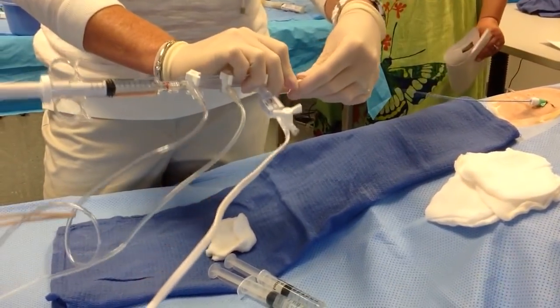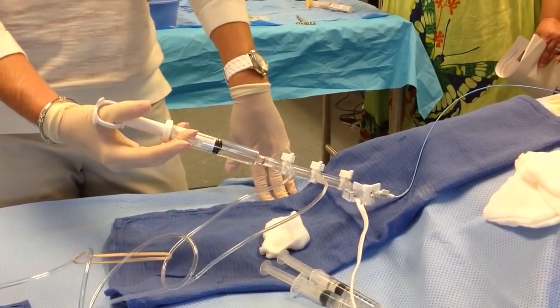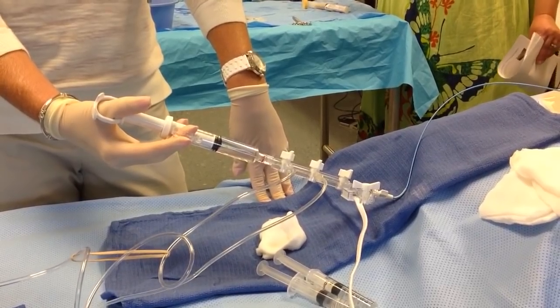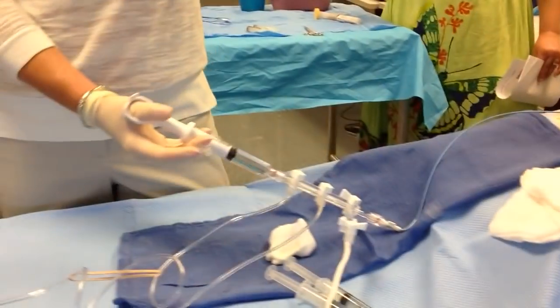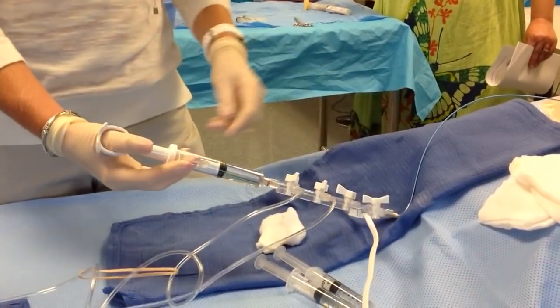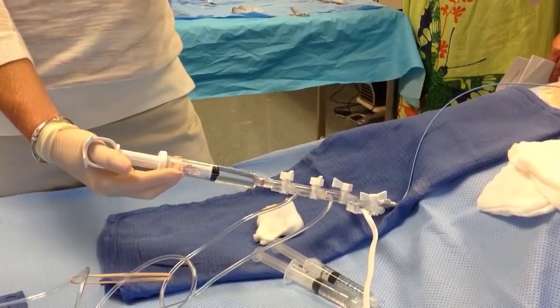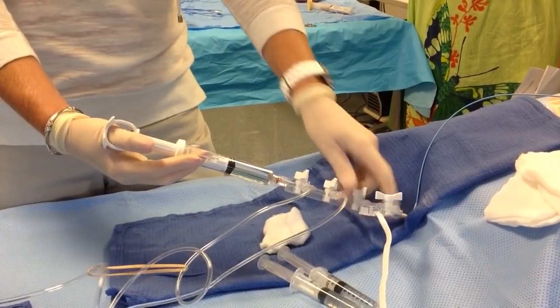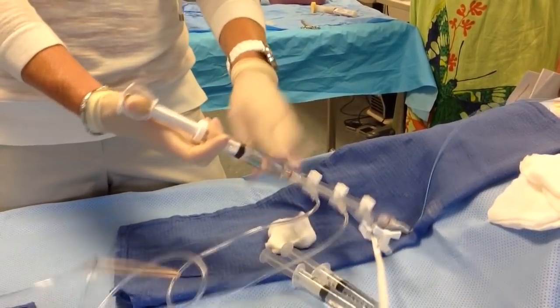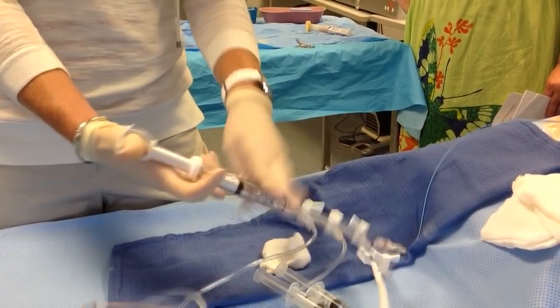Okay. So now we'll connect our injection device here. And what did I say we always do first? Aspirate. But what do we do before that? Check pressure. We always check pressure first. So this is connected on the side of the table to the monitoring system. So this is our pressure transducer. So this is how we get pressure. Okay. So I have it on to the catheter, which is inside the aorta, so we're getting AO pressure. So if pressure looks good, now I turn it off, and now I'm going to pull back, and I'm going to flush. And I'm going to go back on pressure, and I'm going to get my contrast.